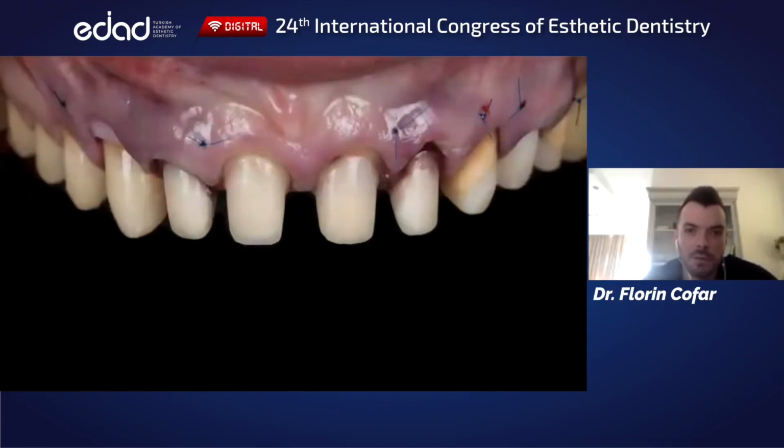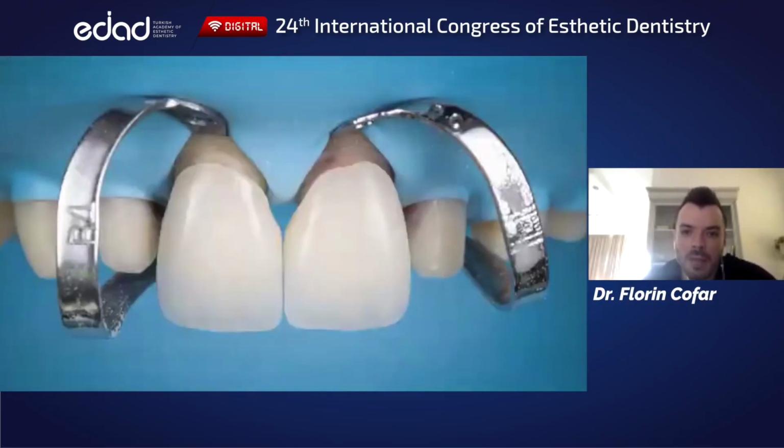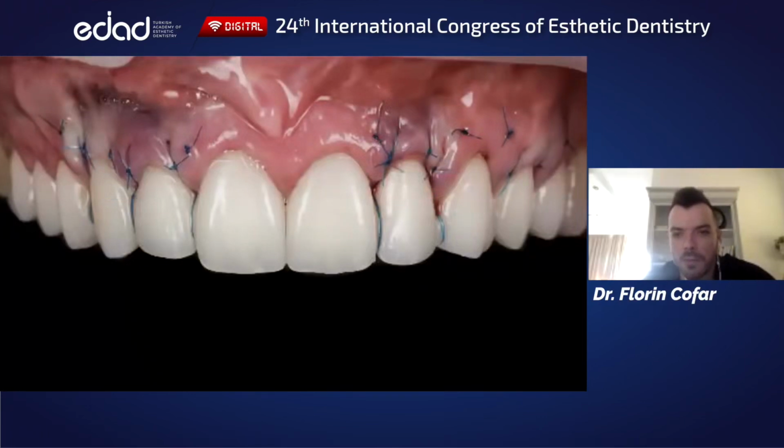We use this, as a reminder, to block the color in the dark roots. Once we have the stabilizing sutures, we can place rubber dam, bond everything else, clean very well, and then put the final sutures that pull the tissue over the contact points.